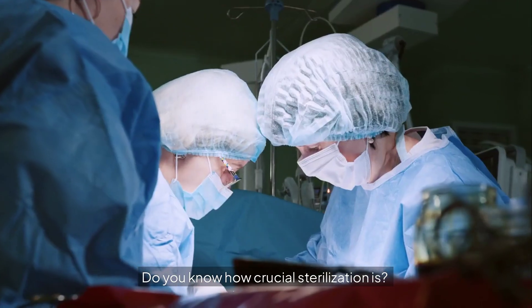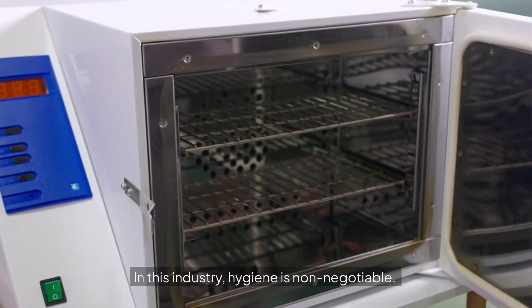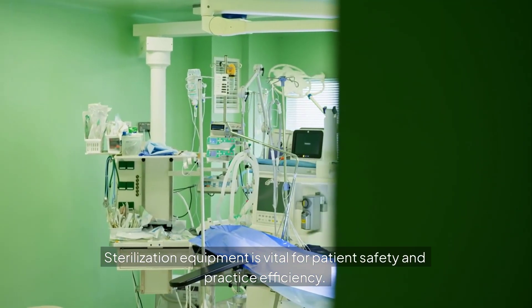Are you in the dental field? Do you know how crucial sterilization is? In this industry, hygiene is non-negotiable. Sterilization equipment is vital for patient safety and practice efficiency.